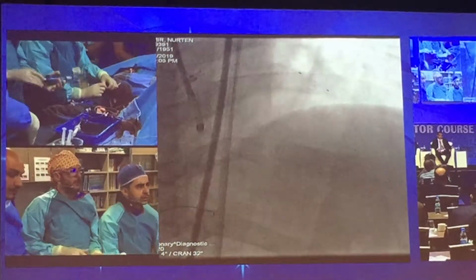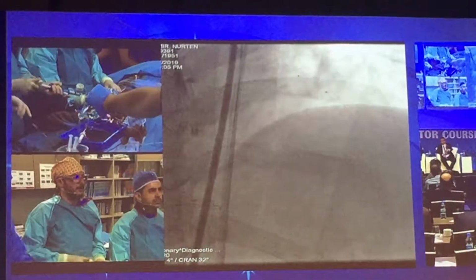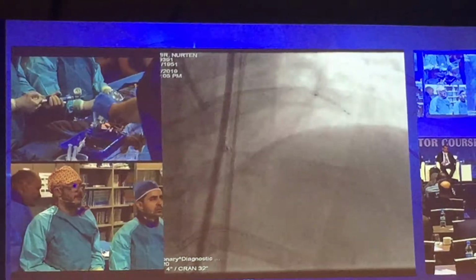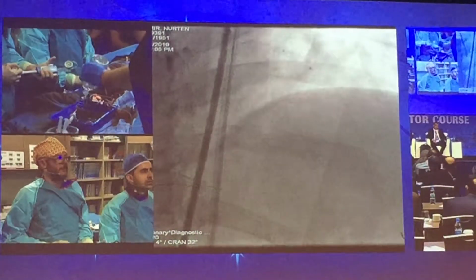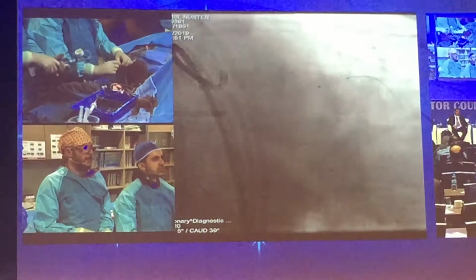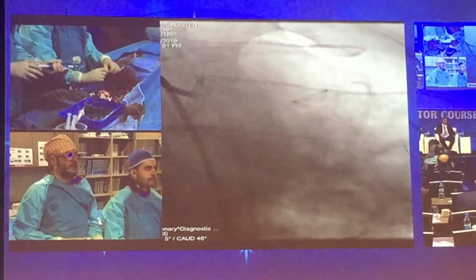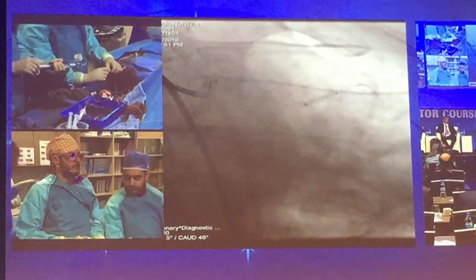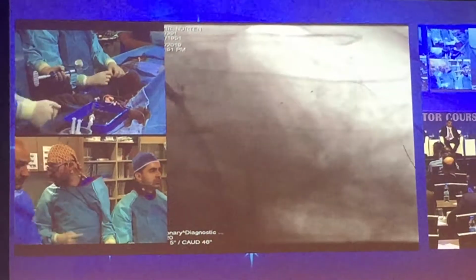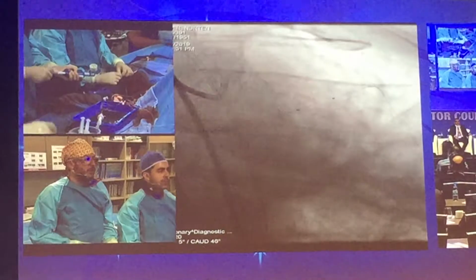Okay. Yes, thank you. Yes. You are inside. Okay, please. Yüksek basınçla çıkalım. Kaç? What was the balloon? Caudal please, caudal view. 2.0 by 15. Okay. 2.5 by 15. 2.5. Kaç? Yüksek. 20. Çok geç gidiyor abi. Benim burada söylediğim oraya 10 saniye sonra gidiyor. Enflate. Ne bileyim bana çok uzun geliyor.